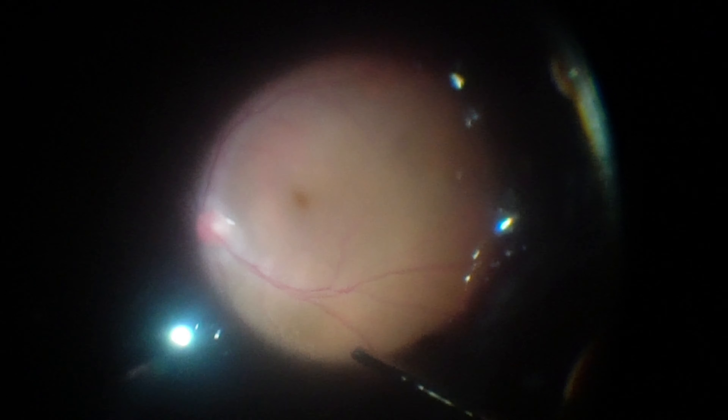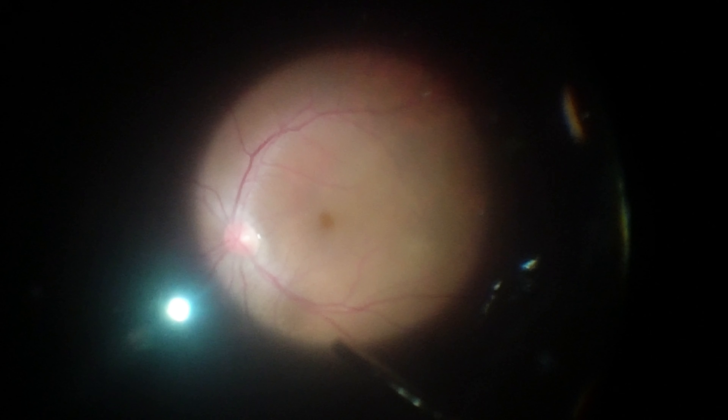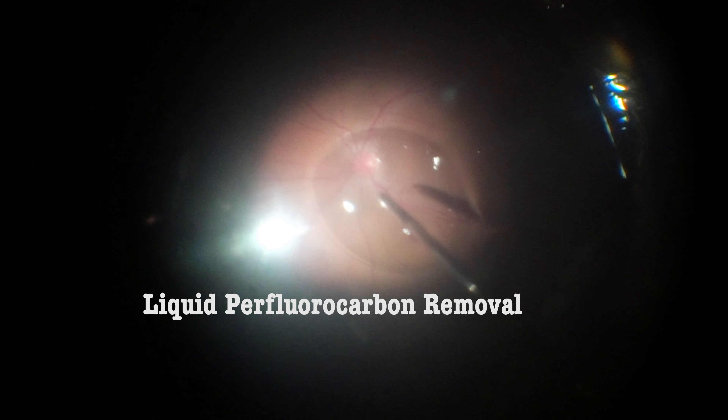An air-fluid exchange is now performed. I now remove PFC with a backflash cannula — you should go after the last droplets at the most dependent position. If you think it's necessary, you may use a macular lens for that reason.